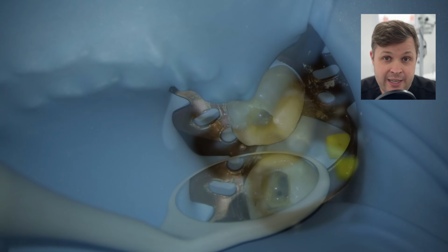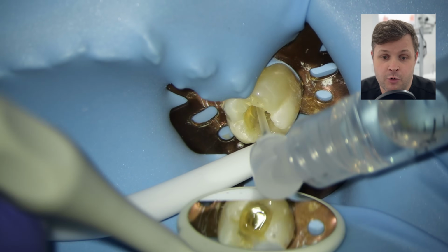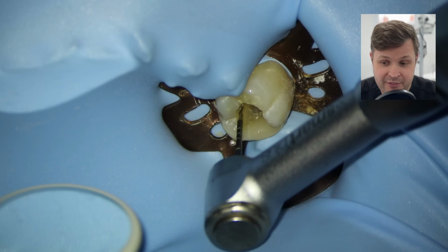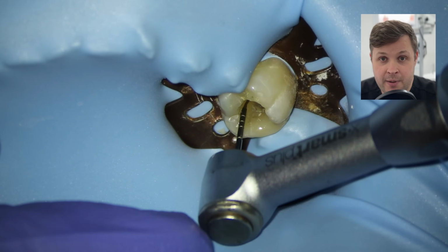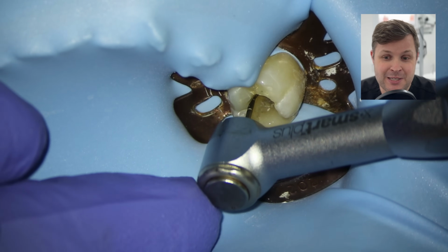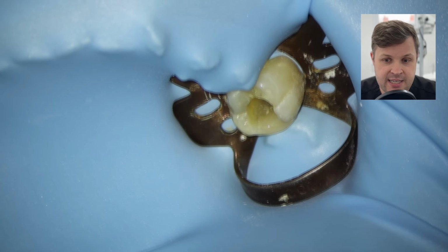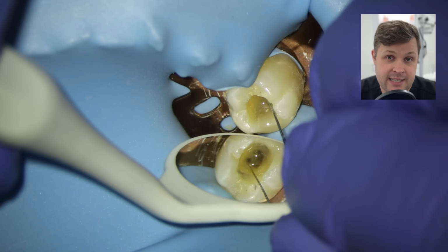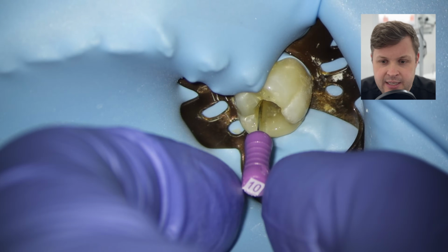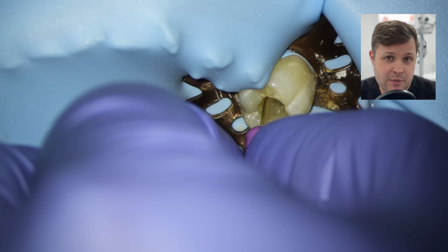Now I'm going to adjust my glide path file and shape that up to 25. You can see that these files are 25 in length. There's no rubber stopper. We're going to just push it all the way to the end, which sometimes makes me feel a little bit nervous, mainly for file fracture. But in this case, if you're really, really careful, you've got less of a risk of fracturing a file. Then I'm going to try and recapitulate with the size 10K file, because I know it was a bit difficult.